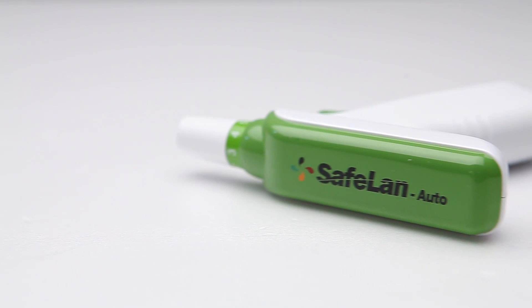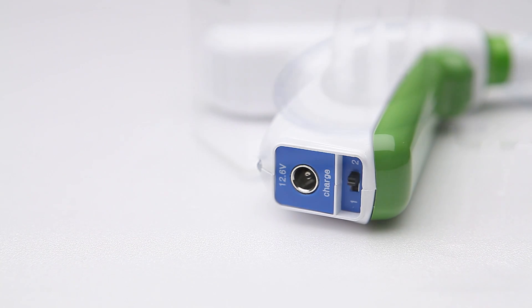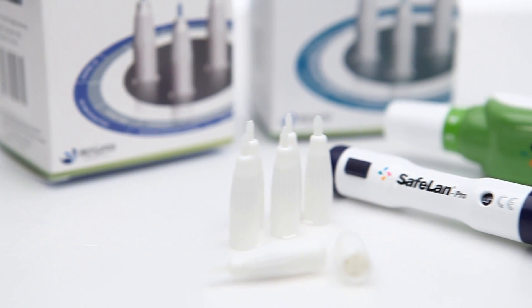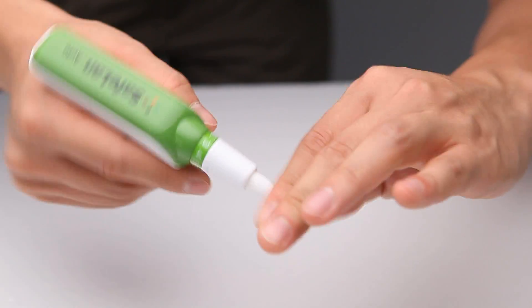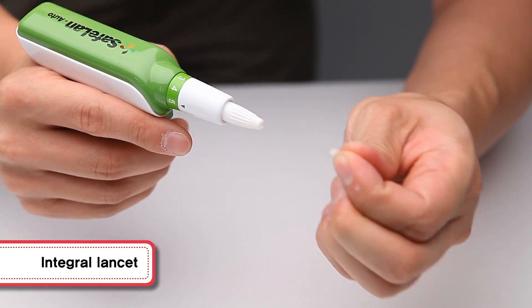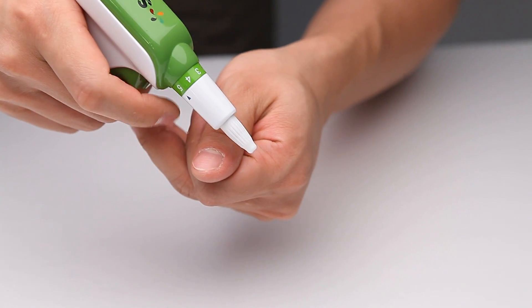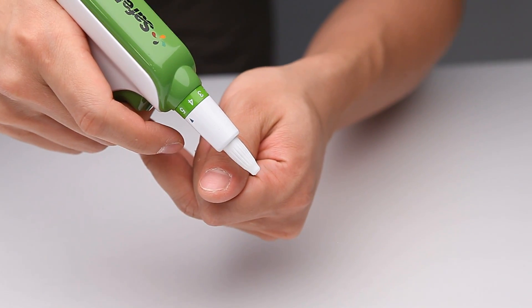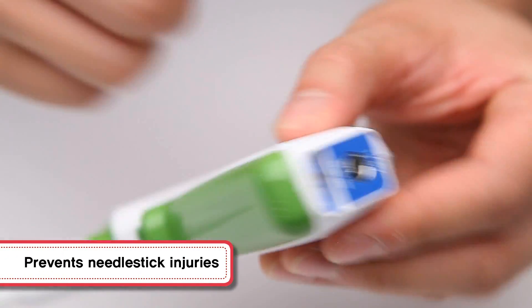Safeland Auto, which uses Safeland 26G, is a product used for bloodletting, similar to bloodletting moxibustion treatment. It uses a lancet that is designed to integrate the needle stick and the protective cap of the blood collecting device. So the needle never protrudes, except when being used, preventing needle stick injuries caused by careless use.